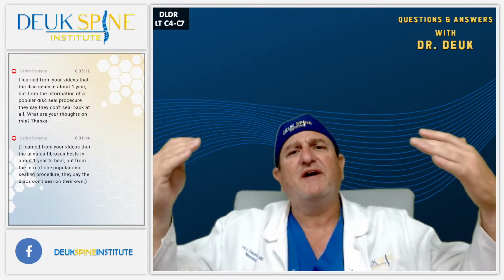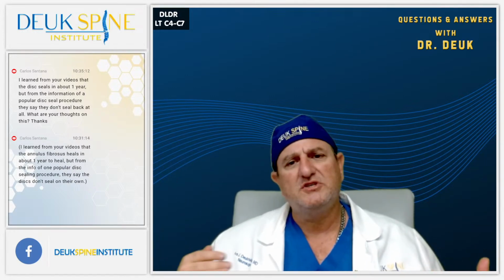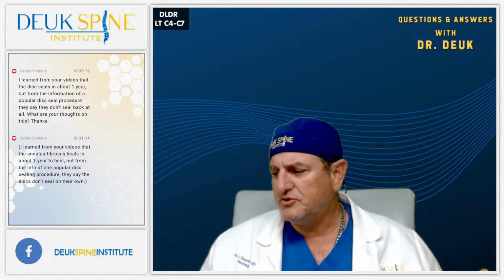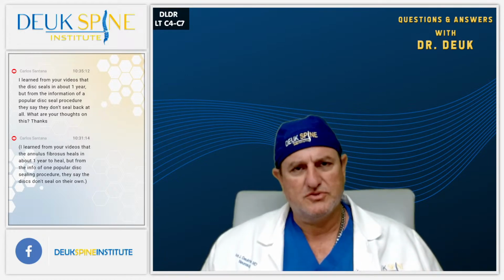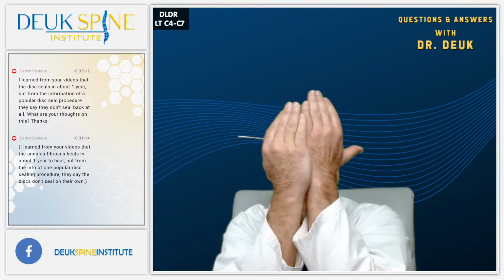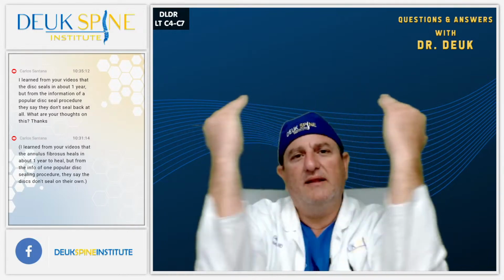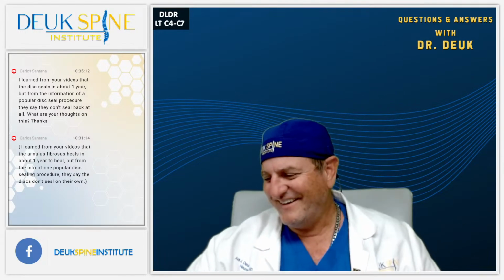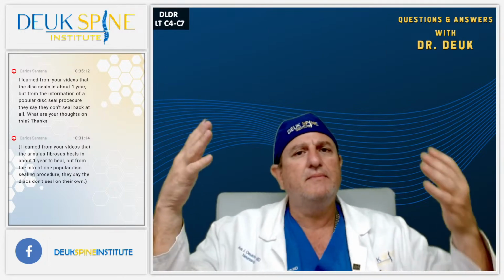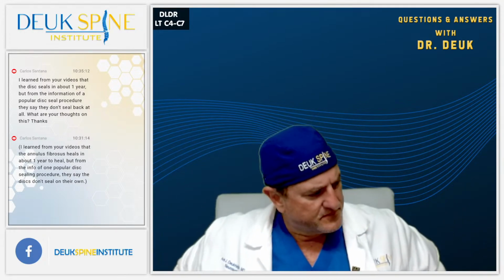Almost all of your tissues except your bone, except your skin, except your brain, have fibers. And those fibers can be spread apart and put back together. You like that? All right, so we're not damaging anything. We're just spreading fibers apart. Over time, they come back together.